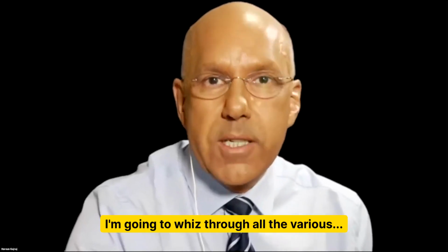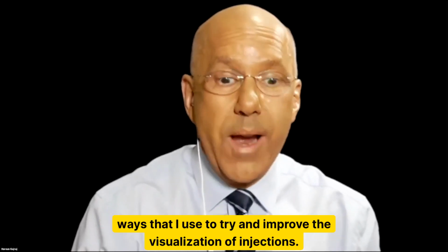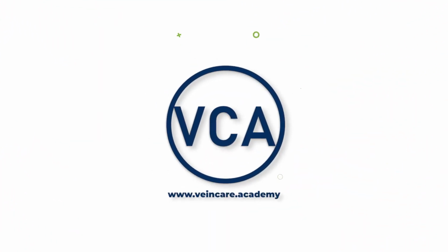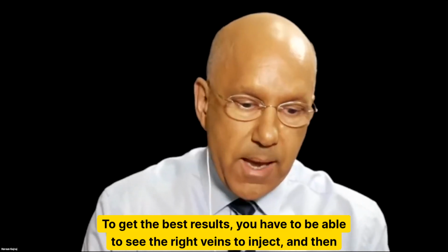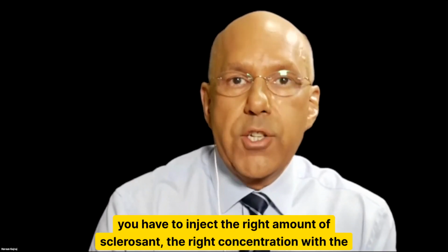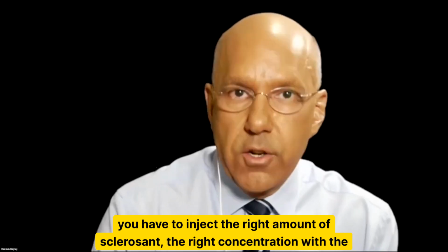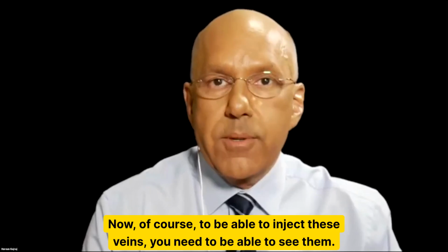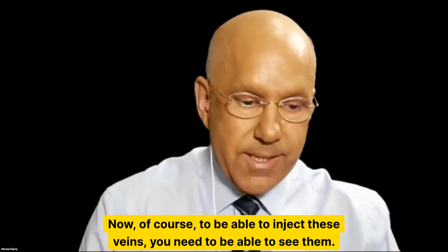I'm going to whiz through all the various ways that I use to try and improve the visualization of injections. To get the best results, you have to be able to see the right veins to inject, and then you have to inject the right amount of sclerosant, the right concentration with the right pressure and volume. Now, of course, to be able to inject these veins, you need to be able to see them.